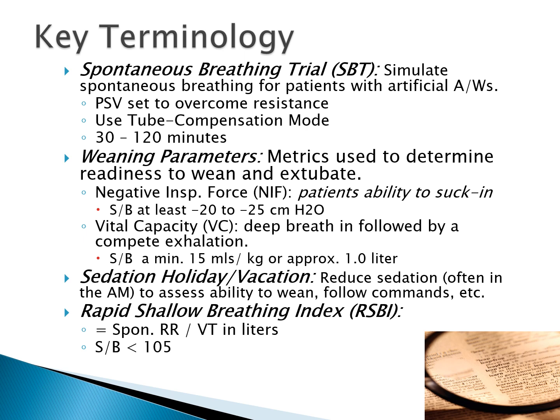If they do in the first 30 or 40 minutes, there's a good chance they're going to tolerate it longer than that. And then another term is weaning parameters. So these are measurements or metrics used to determine readiness to wean and hopefully extubate. And there's many of them. Included amongst them is a NIF.